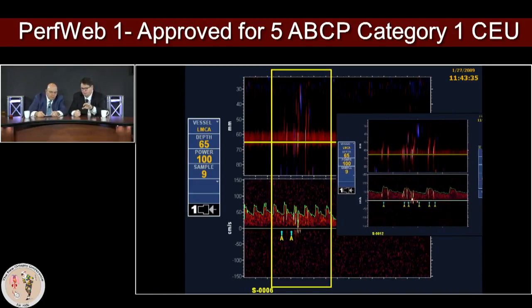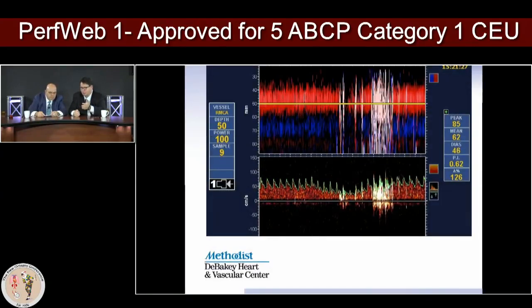And I agree with you, emboli is just one story, but this is how the embolization looks on the screen. On the middle of the screen, that huge dip you see, this is a good Valsalva. The Valsalva, by increasing the pressure in your chest, prevents the venous return. That's the best example. If your venous return is not there, the heart would love to pump, but there's nothing to pump out.